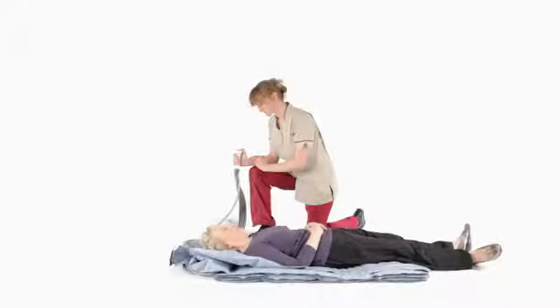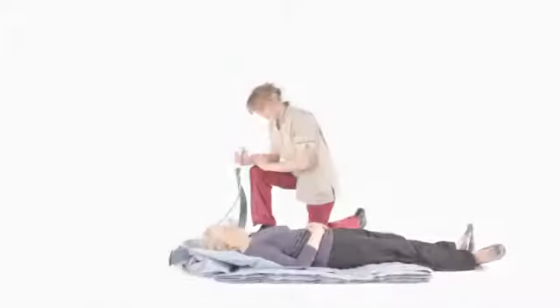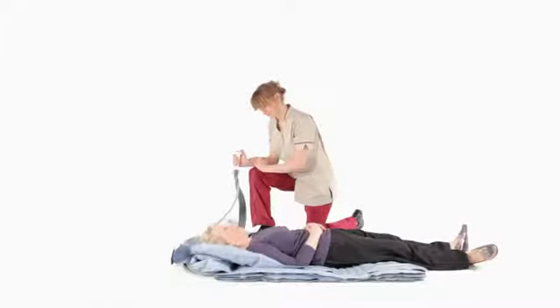The handset is operated by pressing and holding the numbered buttons in sequence, starting with number one. The backrest will now start to inflate.